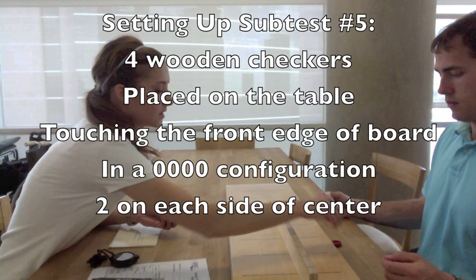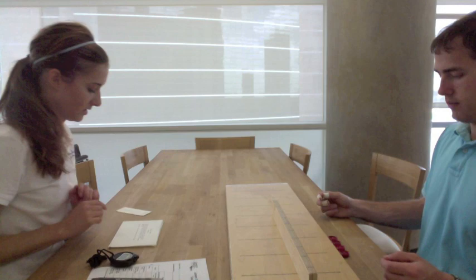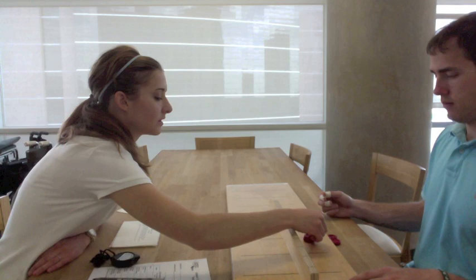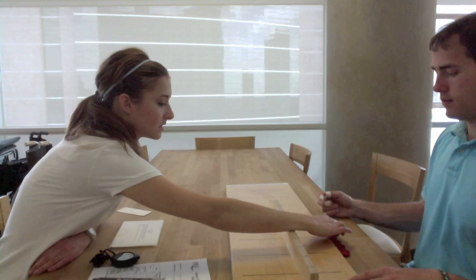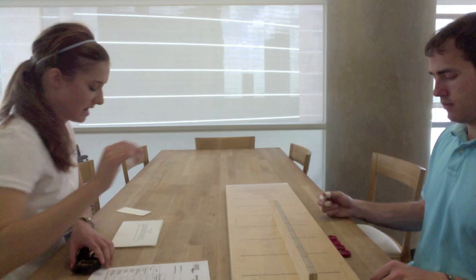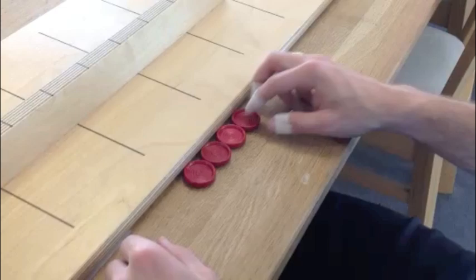The therapist asks if the patient can play checkers, then instructs: 'Place your left hand on the table. When I say go, use your left hand to stack these checkers on the board in front of you as fast as you can, one on top of the other. You may begin with any checker.' After the left-hand attempt, the same task is repeated with the right hand.